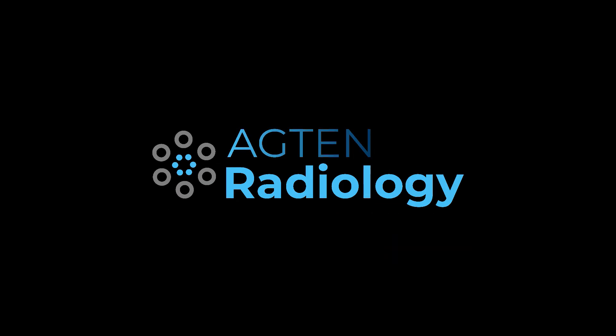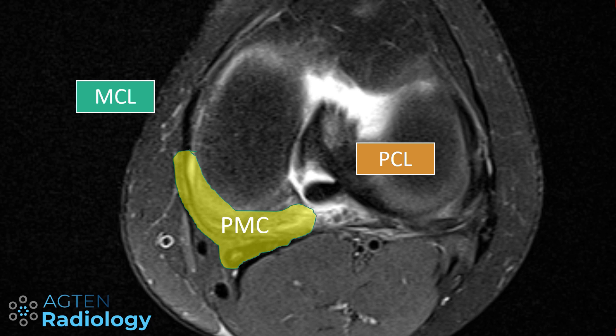In today's video, I show you the MR anatomy of the posterior medial corner on MRI. The posterior medial corner of the knee is located between the MCL and the PCL. To be more specific, everything behind the posterior border of the MCL and the medial border of the PCL. Everything in between here, including the semimembranosus tendon, is considered to be part of the posterior medial corner.